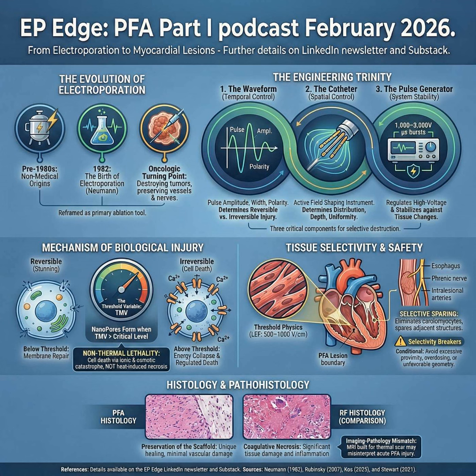used to. That creates an imaging pathology mismatch. Tools like late gadolinium enhancement were built around thermal injury assumptions. In PFA, acute imaging changes can look large, then evolve differently over time. So interpreting lesion size and durability by imaging alone can be tricky. Clinically, the implications are practical. Acute PV isolation may include a stunning component, EGM reduction is necessary but not sufficient, and acute silence can be misleading. So that's part 1 in a nutshell.